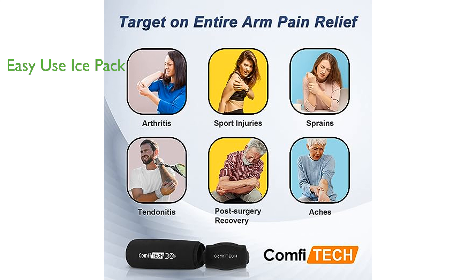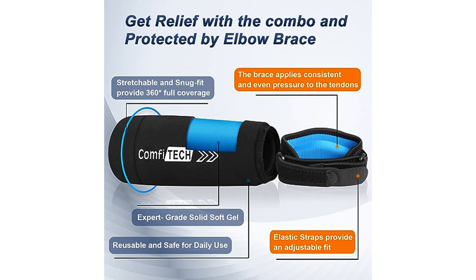The ice pack for elbow tendonitis is designed for ease of use, remaining flexible and soft even when frozen at minus 18 degrees, and is able to adapt to the shape of your elbow, forearm, or wrist to provide 360-degree compression therapy.